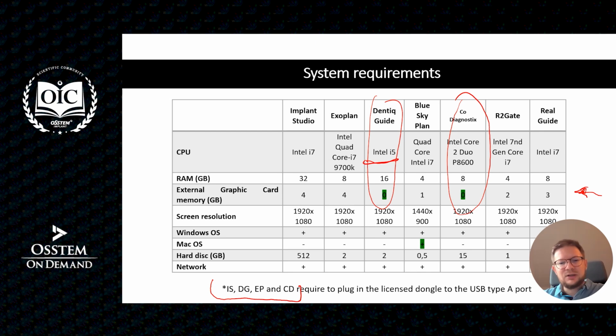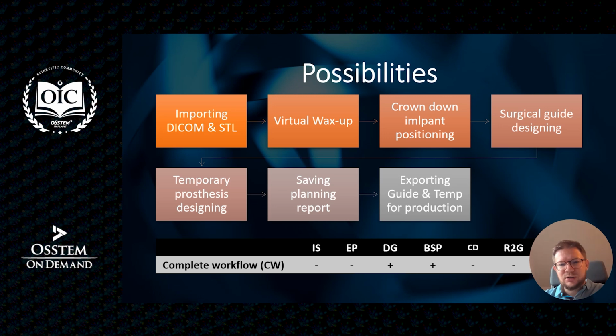I think that the manufacturers should switch to USB-C, or even offer some different solution to provide, I don't know, an internet license or something to be registered with the software, but not require these kinds of dongles placed in the computer.